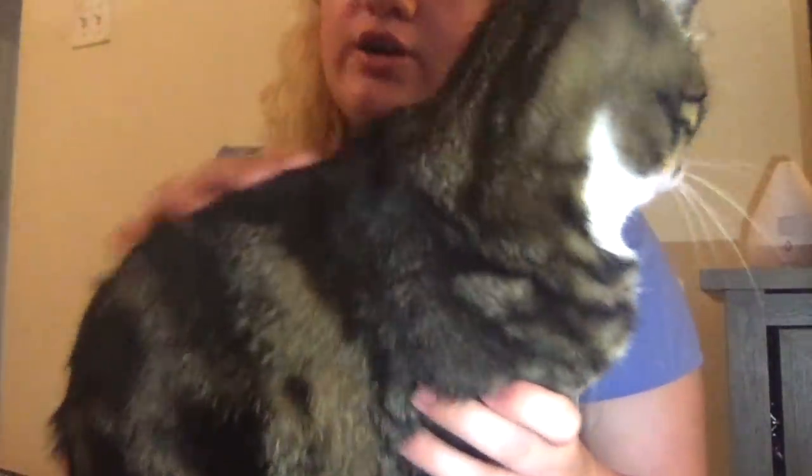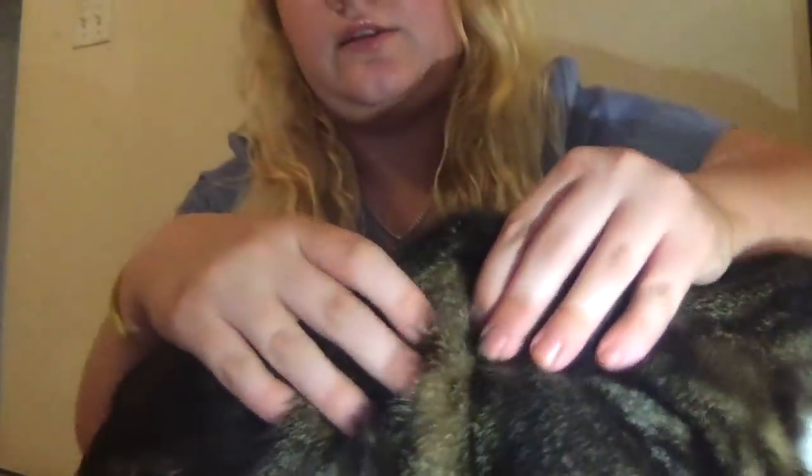Here's my cat — I'm going to show you. Pull the skin up right here, and once you do, place the needle right into that pocket. Once you poke your dog or cat, you want to see the skin starting to fill up with fluids and make a bubble shape — that's what you're looking for. If it starts leaking outside the skin, that usually means you went through, which happens with older patients. Just push the needle back slightly and keep squeezing.